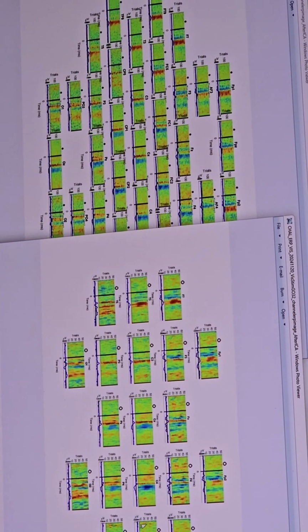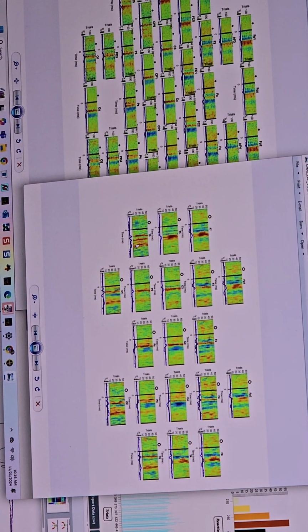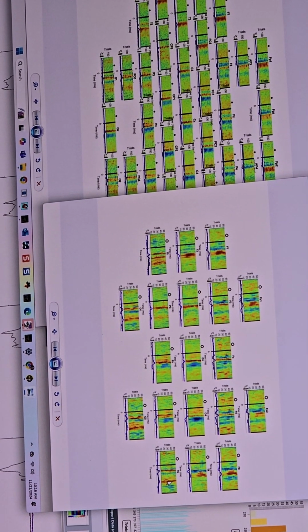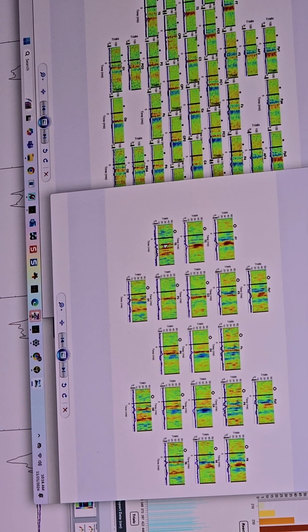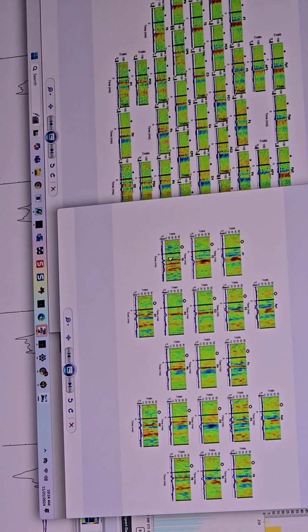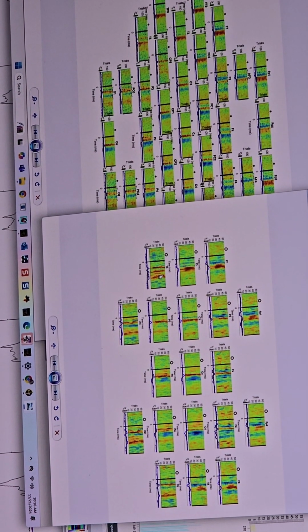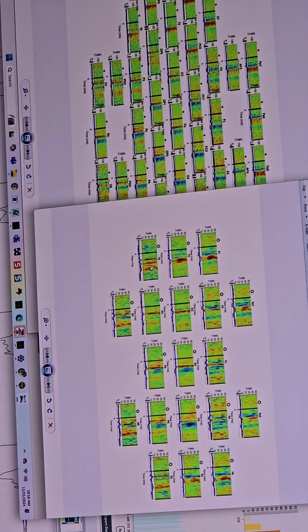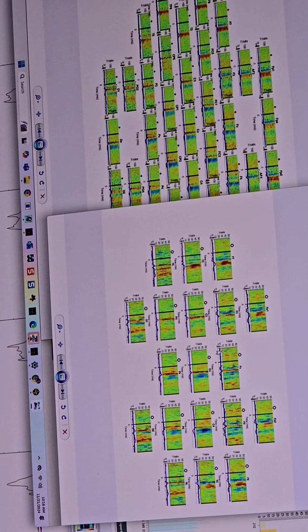Every single one, except F4, which seems the worst, is showing some strong signals. Now, T5 and T6 normally show it too, but remember, this side is the one with the slowing. So this is still a work in progress. That's helped most by the working memory training you've done. I think so. These have less slowing, and they're starting to look better.